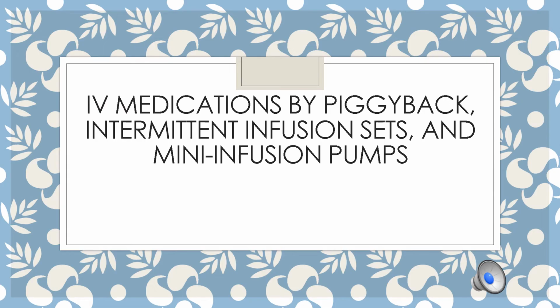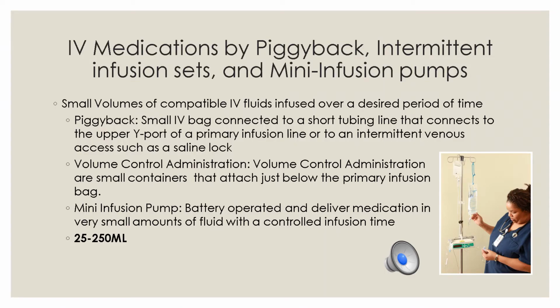The second portion of the skill is IV medications by piggyback, intermittent infusion sets, and mini-infusion pumps. And you're going to demonstrate IV piggybacks and volume control containers on your checkoff along with IV bolus medications. IV medications by piggyback, intermittent infusion sets, and mini-infusion pumps.